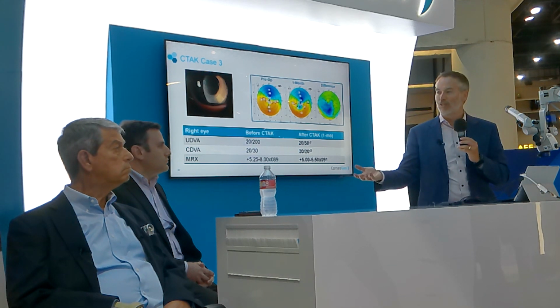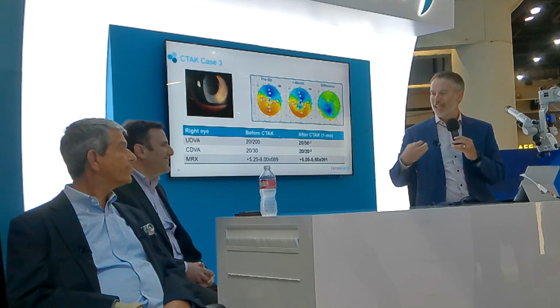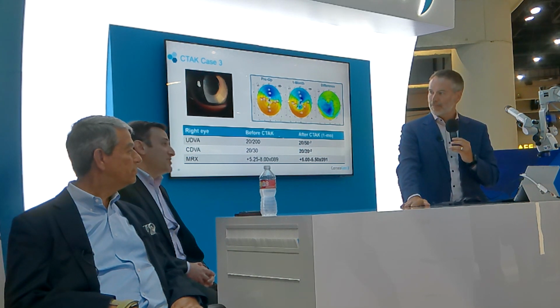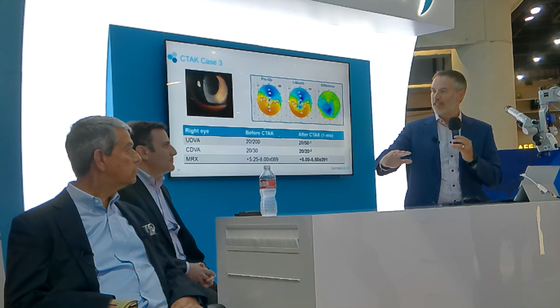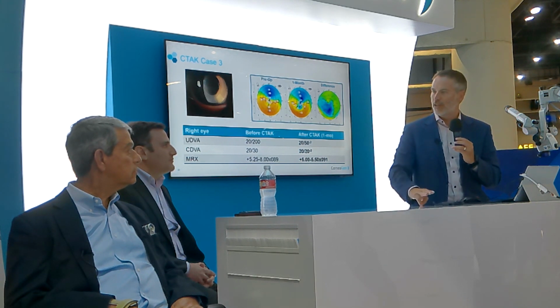Like we've done, thank you for letting me include myself in all the work that you guys have done. How many total have been done, CTAK? Over 60. How much different is the algorithm and the shaping of the corneas at cornea 60 than it was at cornea number 1? Did you guys get it right out of the shooter? Has there been a fair amount of, okay.